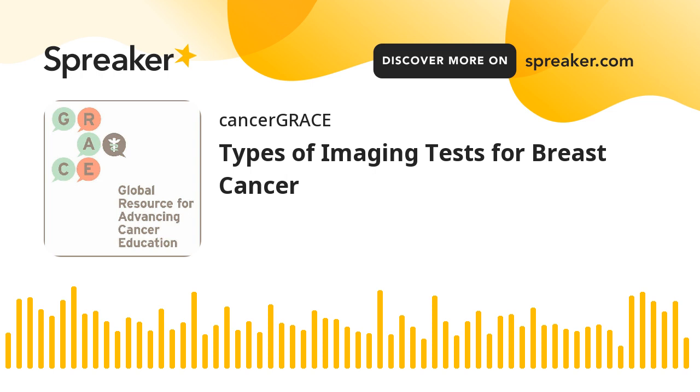So breast ultrasound is another imaging modality that can be used, even though I must say it is not used commonly for screening purposes. Ultrasounds do not use any radiation. They use a probe and sound waves to generate images of the breast tissue. Usually, breast ultrasounds are used when we see an abnormal area on the mammogram and we want to look at that area in more detail. They may also be used to do biopsies of suspicious areas. For screening purposes, they can really be used when women have dense breasts.